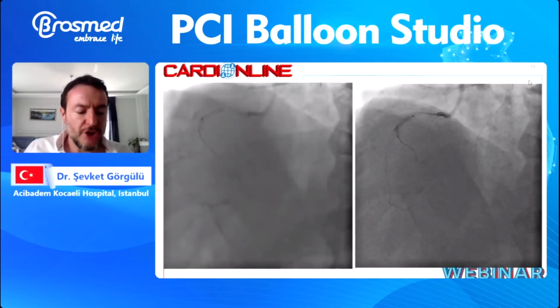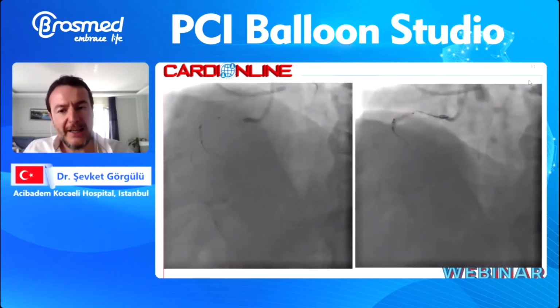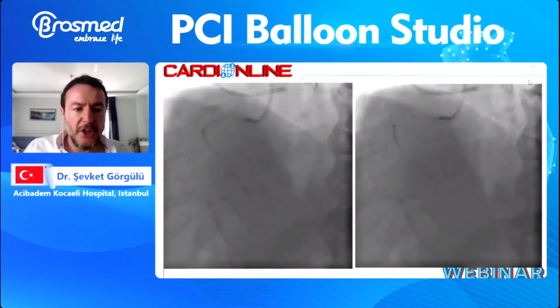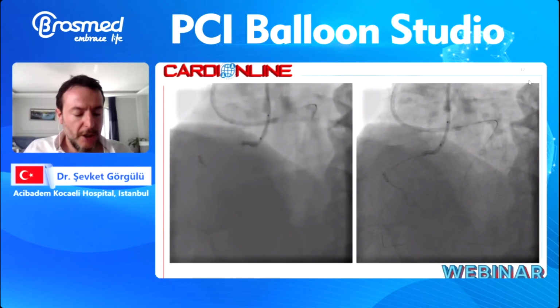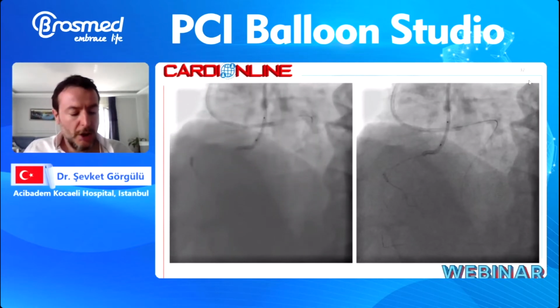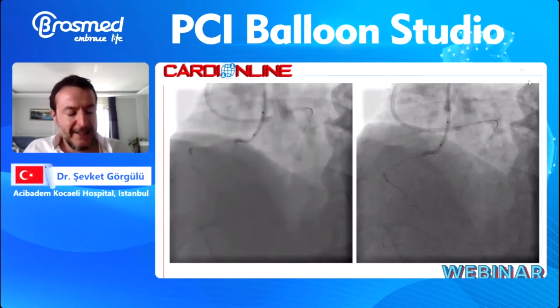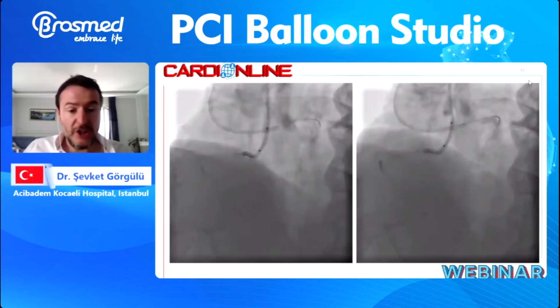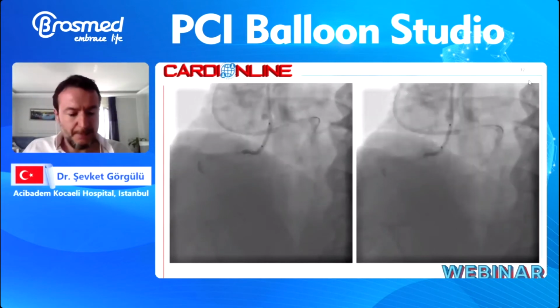First, we wanted to touch the balloon with the wire, but luckily it went into the antegrade guiding catheter, as you can see here on both panels. Here, we trapped the wire and the shaft of the anchoring balloon. The micro went into the guiding catheter. As a general rule, one should not trap the anchoring balloon, as you can compress the lumen and hinder the deflation of the balloon. This kind of scenery has never happened to me with the Artemis balloon. Of course, it doesn't mean it will not.